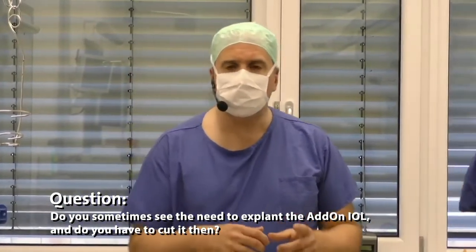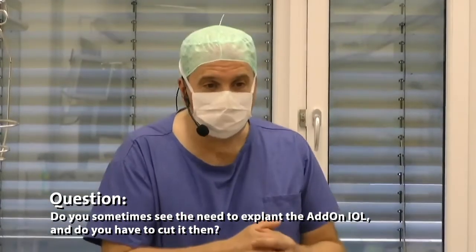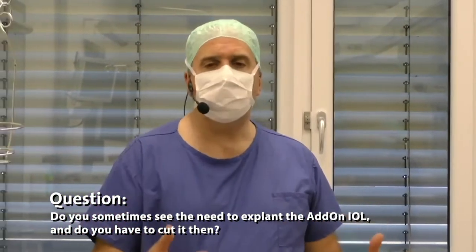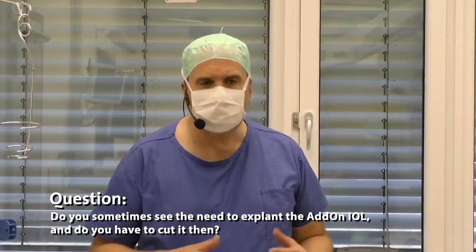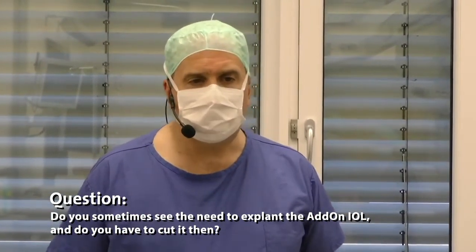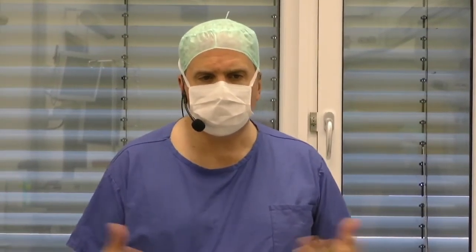Yes, a very good question. Thank you for that, because if there's a need, and I see in this question that obviously in all parts around the world there might be some need. I see the need if the patient, after half a year or 1 year, is still complaining about the side effects, tells me that this is not the way I want to see and I want to live, and I want to get rid of this and accept the glasses for reading. Then I explant it, and then I cut the lens. You can fold it back as well, but I prefer, because of better scissors and smaller forceps, we have a special setting for the explantation. I prefer to cut it through and explant the lens in halves.